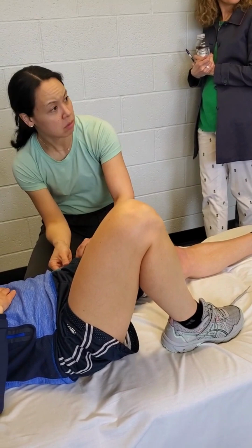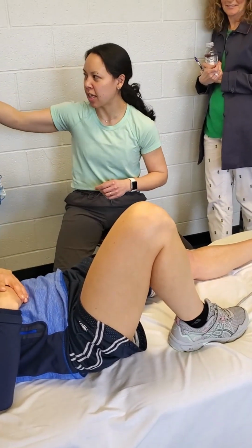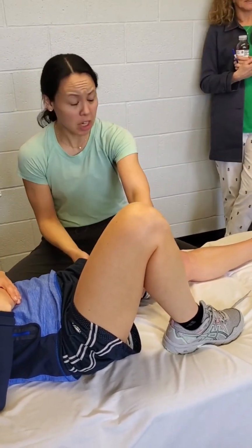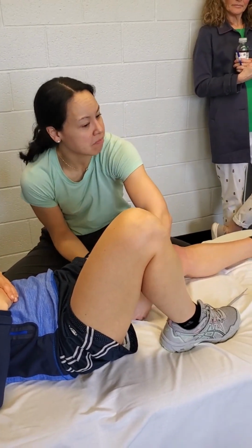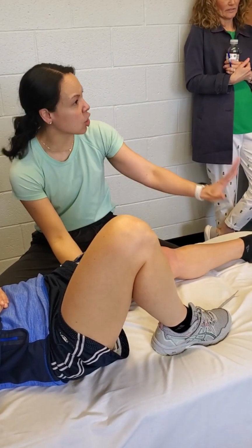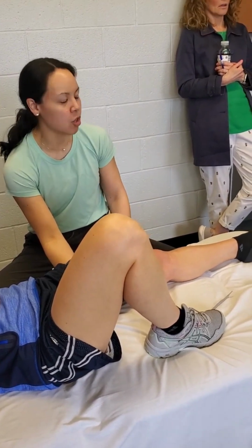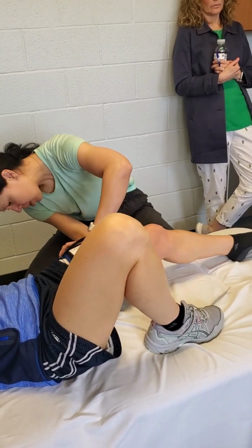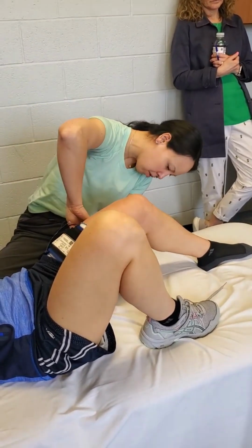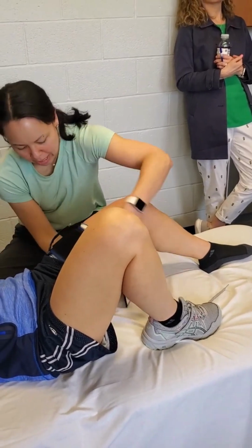What if someone had a blood clot? That's actually one of the things we're talking about. It can be a contraindication or a potential risk factor, but generally the literature shows that it's safe. It doesn't cause blood clots, but if they already had clots, like if they have a thrombophilia, then yeah, it's something you probably have to clear with the doctor. There's a little algorithm that you can use. Where the heck did I put this? Oh, here it is. So yeah, and then you just unstrap her.